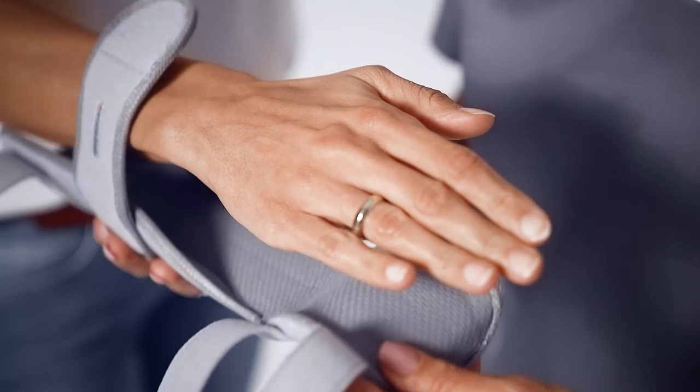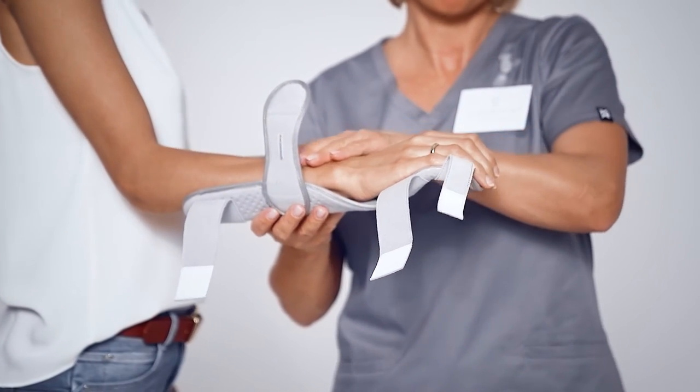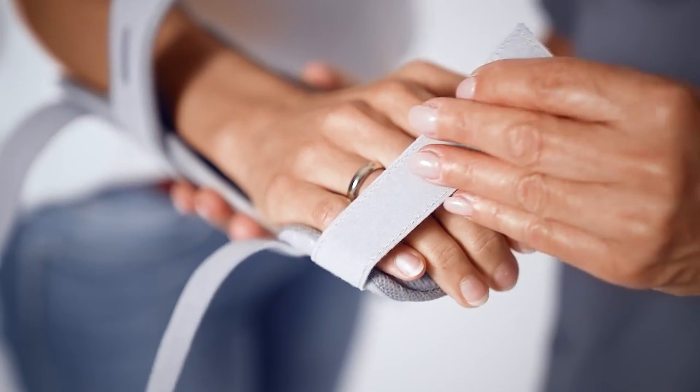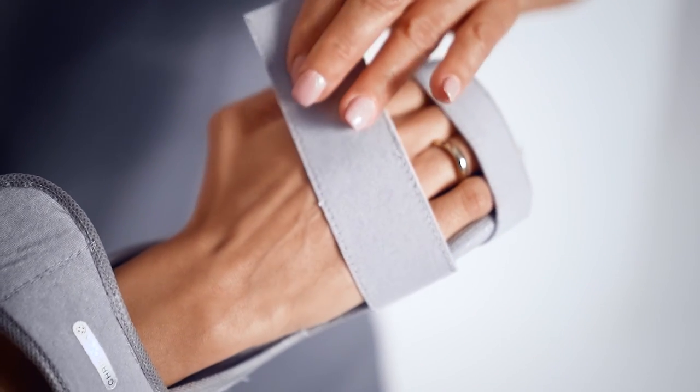Place the forearm with the palm facing down into the pre-shaped orthosis. Adjust the orthosis with gentle pressure to the hand and forearm. Fasten the bandages over the fingers, hand and forearm.